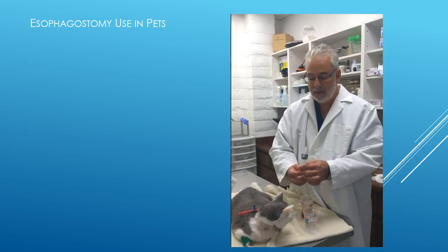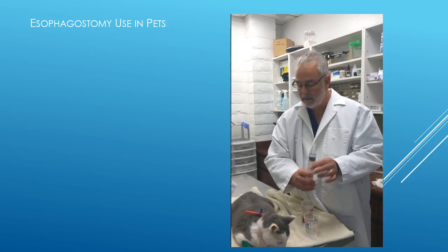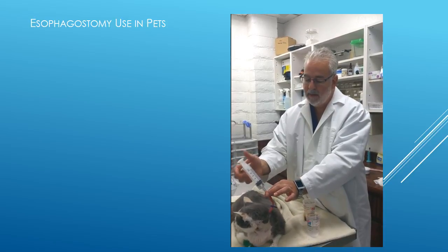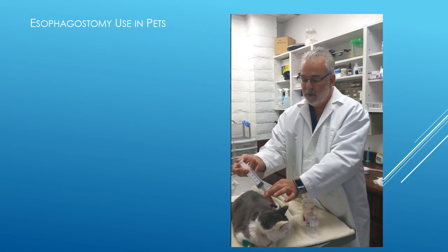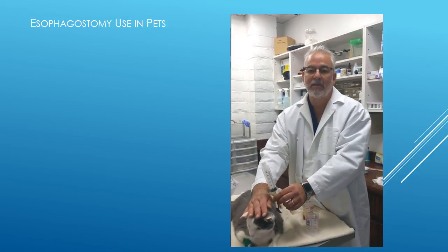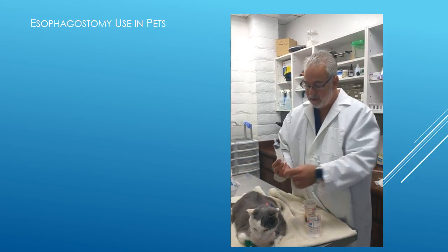We're going to use our catheter tip syringe and suck up about 10 cc's of water, as you can see right here. It doesn't matter if you have air in this because it's just going into the stomach. We introduce our catheter tip into the end of the tube, holding it tightly so it doesn't squish out, and then gently and slowly introduce the water. If there's a problem, either the water won't go because the tube is kinked, or if it's turning backwards, you might see some fluid coming out of the cat's mouth. If either of those things happen, you need to give us a call. Then we remove our catheter tip syringe.